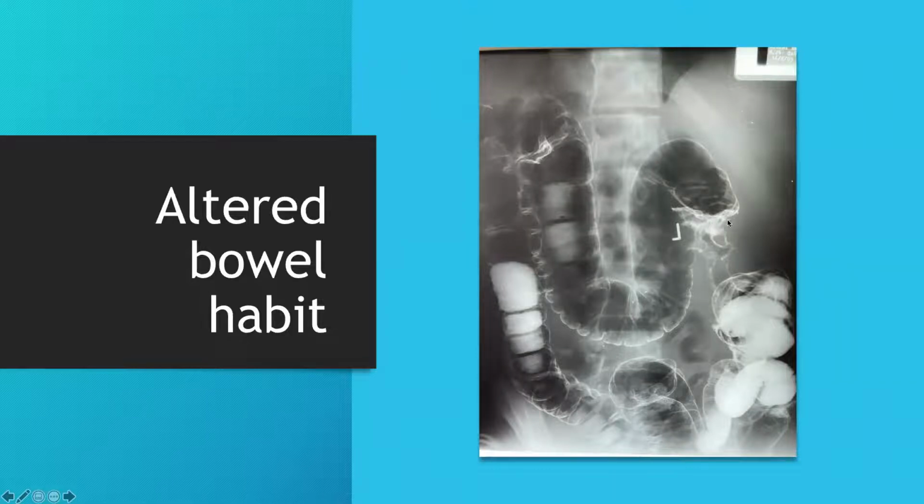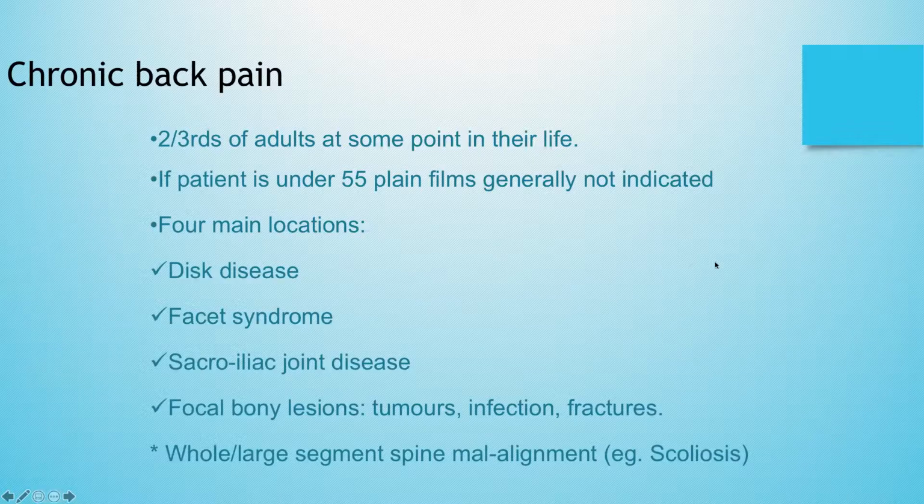So here we go. There is an annular constricting upper colon lesion consistent with carcinoma of the bowel. This is called colonic cancer.